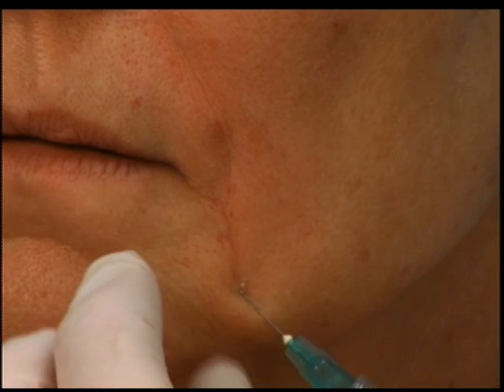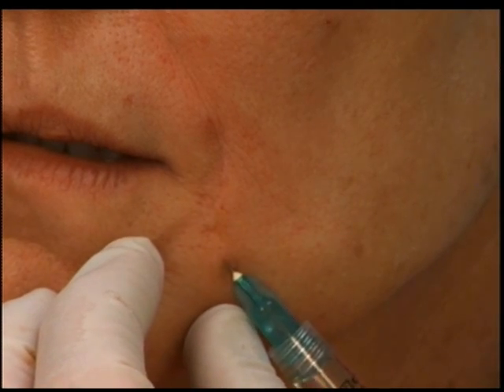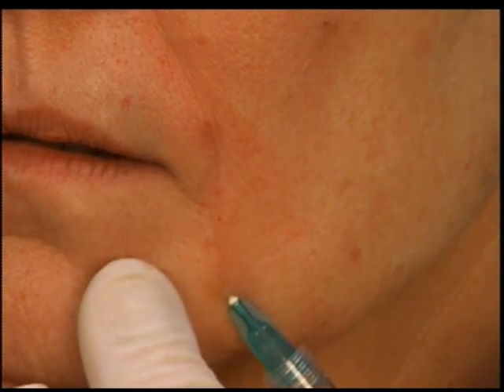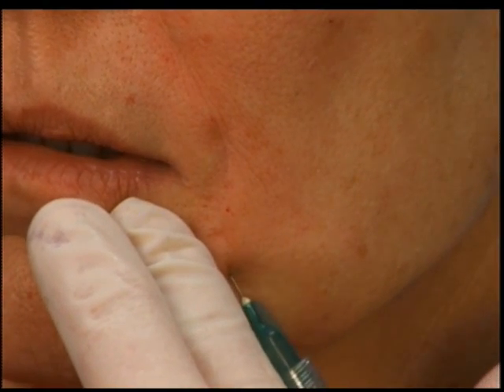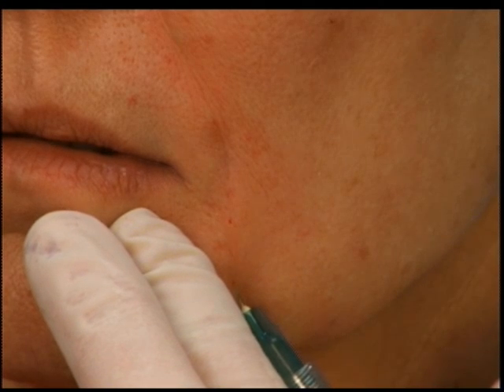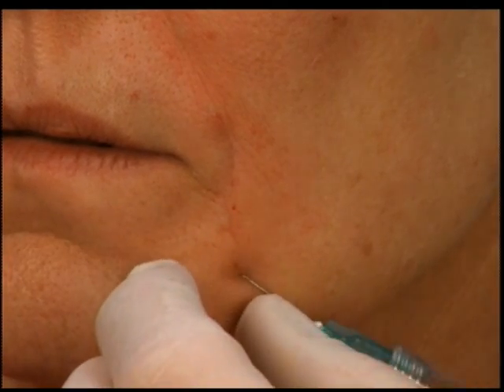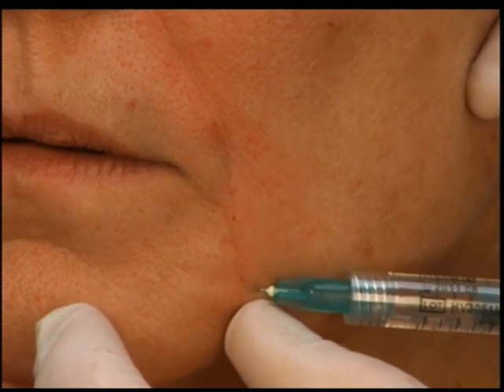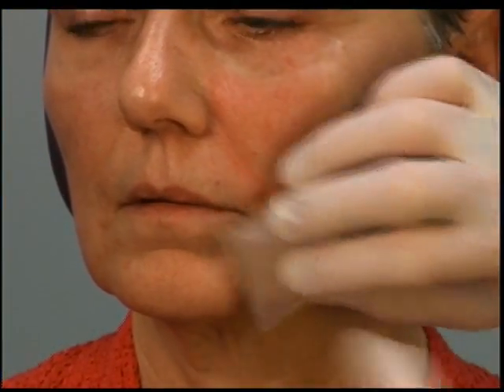Now I'm subdermal again, going up into the corner, medial to the fold just to lift it out. You're putting in a fair amount — probably about a half syringe on each side. Then going across to get the bottom part of the chin, and doing a little fanning right here to lift up the corner and give it a little more horizontal support.